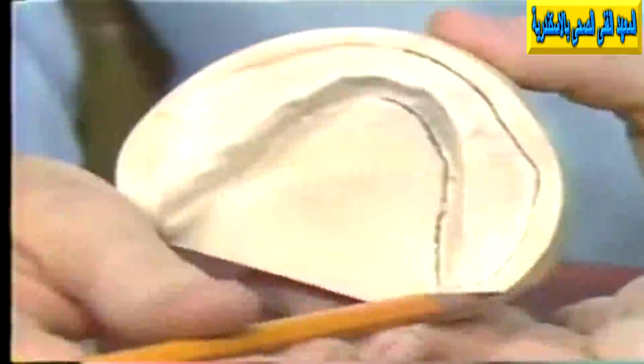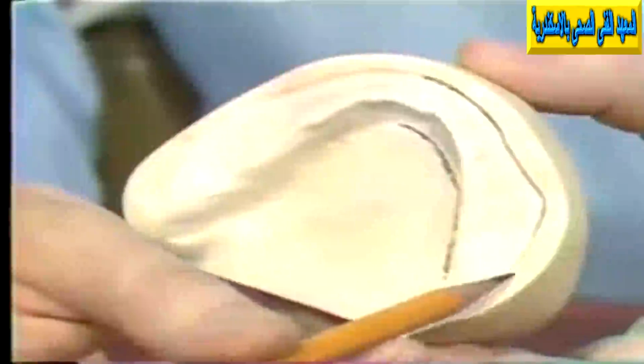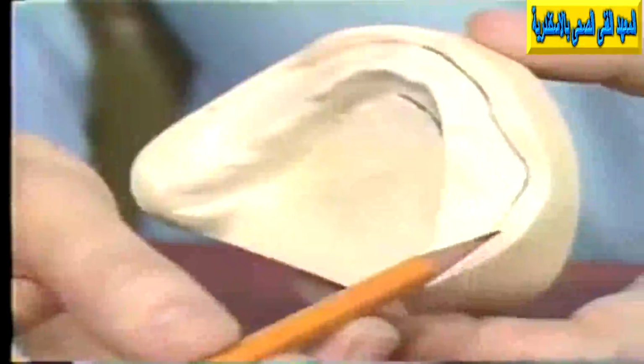And again, in the lower, I have simply outlined the junction of the end of the tissue surface and the beginning of the boxing edge, or the artifact. When we wax the dentures and when the dentures are processed, this tells us exactly where the border of the denture should be. So in trimming the final master cast, regardless of which method you use, we want to end up with this configuration.